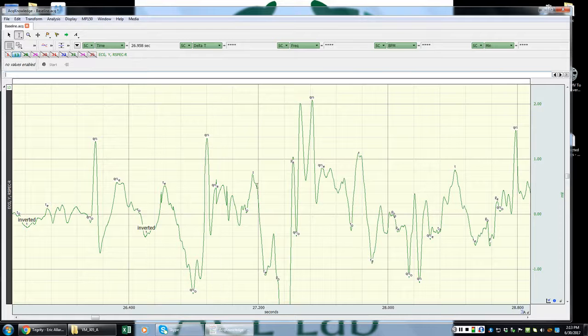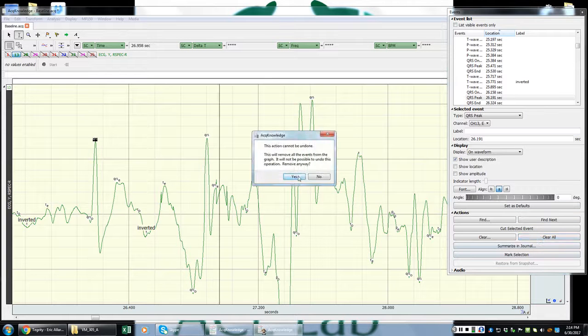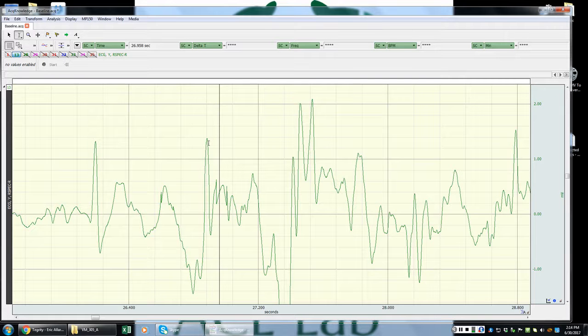Okay, now the question becomes, well, is that an actual QRS right here? Should that be our QRS? What about here, or even maybe down here? Okay, so for the next one, what I'm going to do, first and foremost, I need to get rid of these waveforms. So I'm just going to click on Edit, and I'm going to clear all. Okay, and again, I need to look at the distance and the shape.